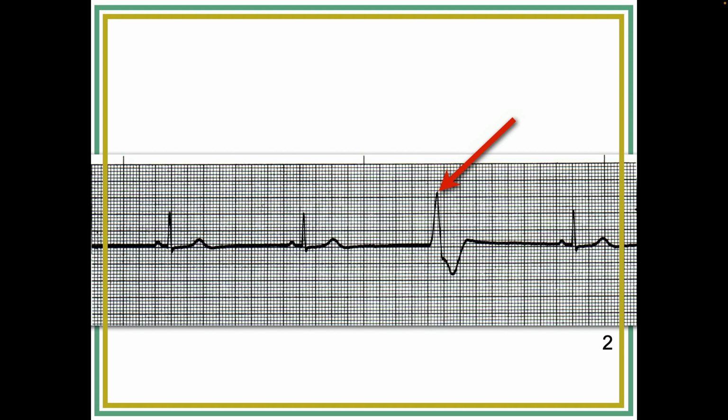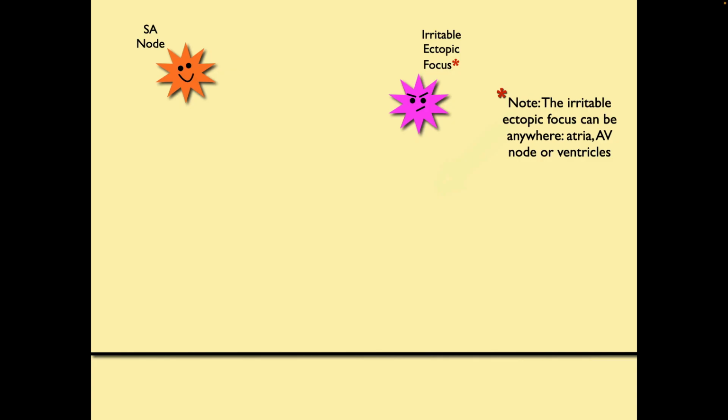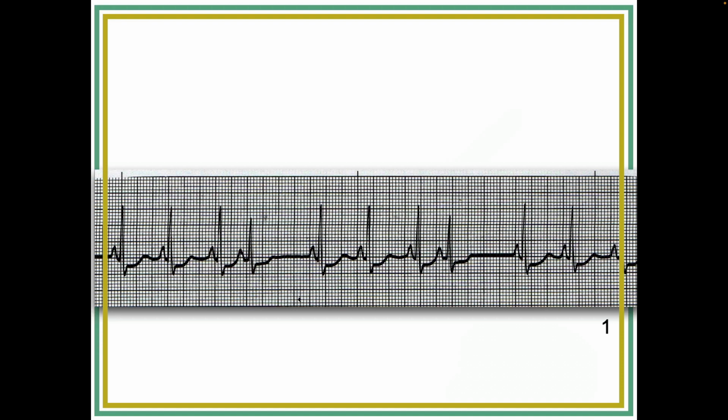Okay. So for me, the way that I think about it is, let's go back. In this particular case, the underlying rhythm actually is regular, but the overall strip is made irregular because there's two premature beats. But they're going to come in at the same time each time, so it's like every 3, there's one. Oh, I see. Yeah, then you could say, yes.